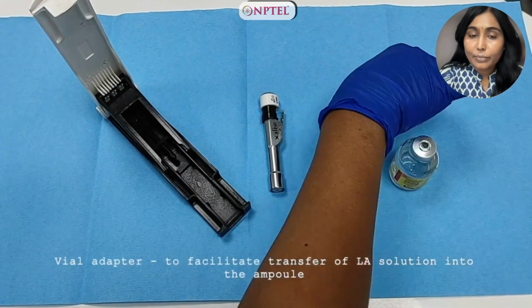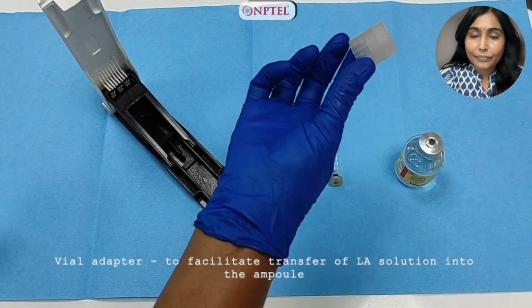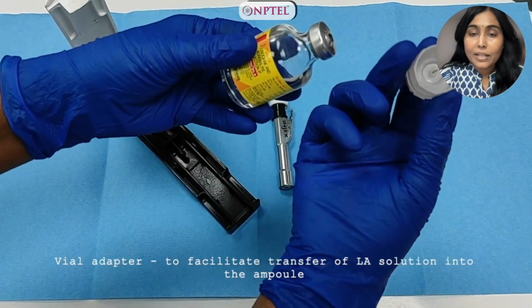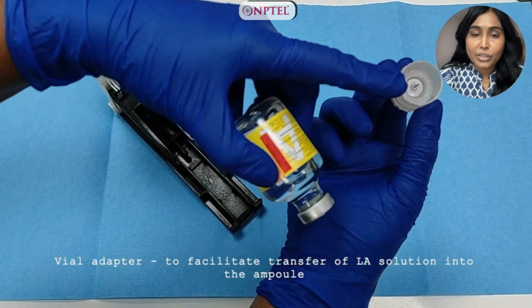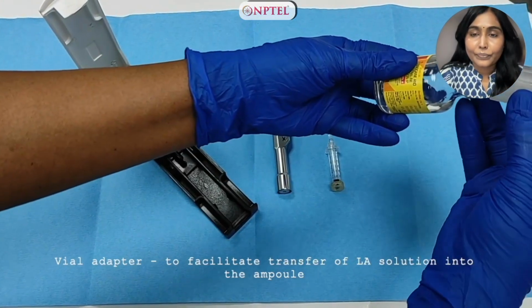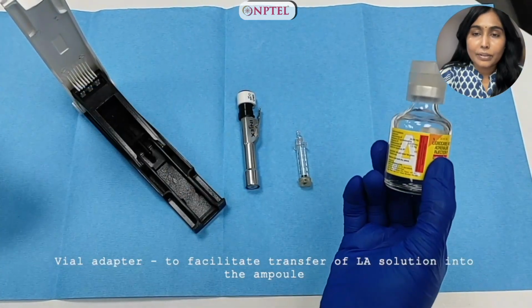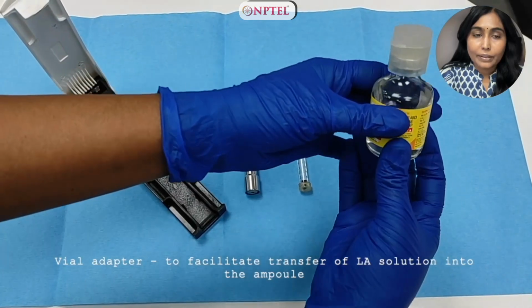This is our standard multi-dose vial. This is a vial adapter to facilitate transfer of local anesthetic solution to the ampule. That has a needle which pierces the rubber top.